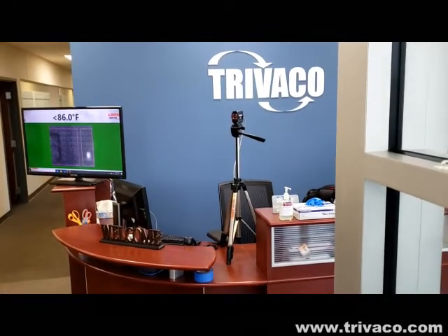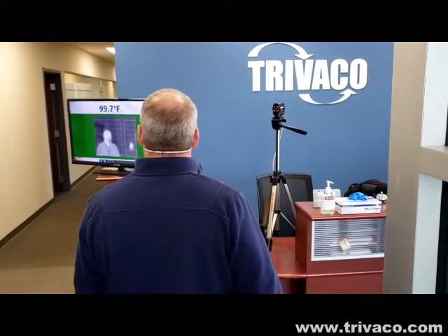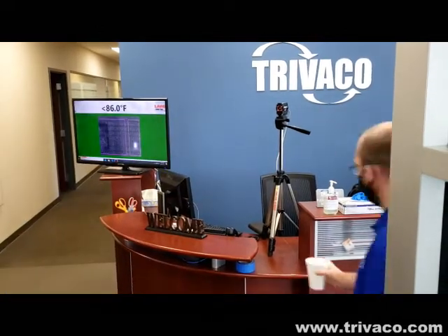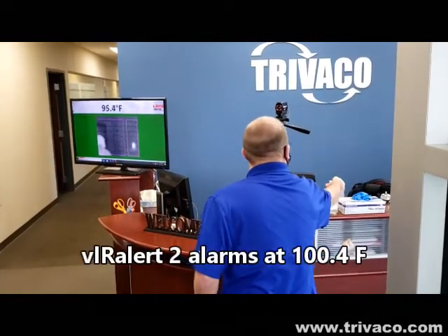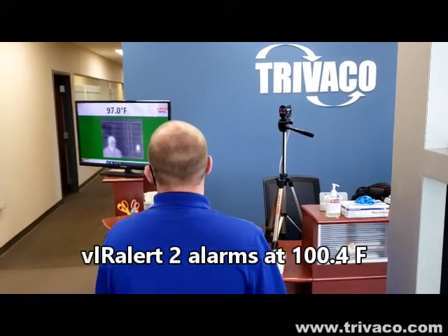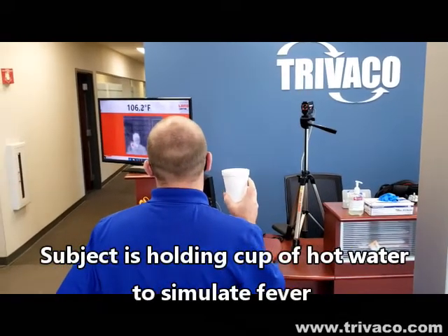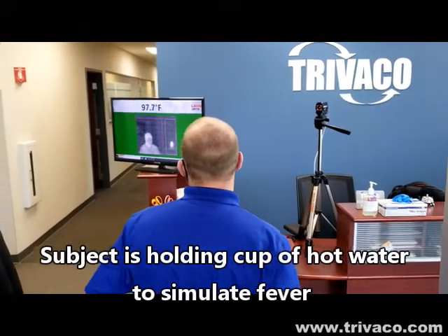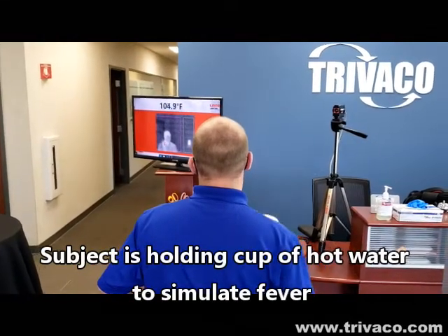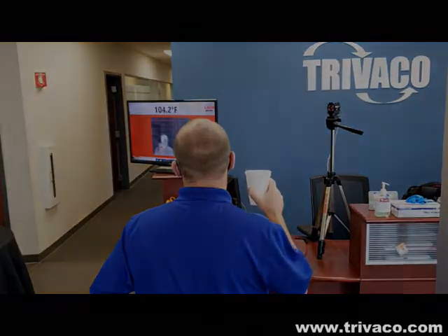Subject one is entering — okay. Subject two follows. For demonstration purposes, he's going to utilize a cup of hot water. As he raises and lowers it, you can see in the background the image and the quickness of response of the system.